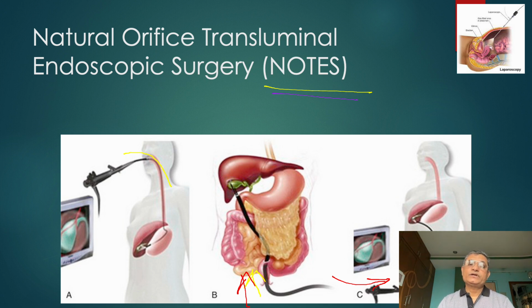So NOTES stands for natural orifice transluminal endoscopic surgery. It's a very novel technique. It's also a minimally invasive surgical technique. The aim is to reduce the invasiveness further.